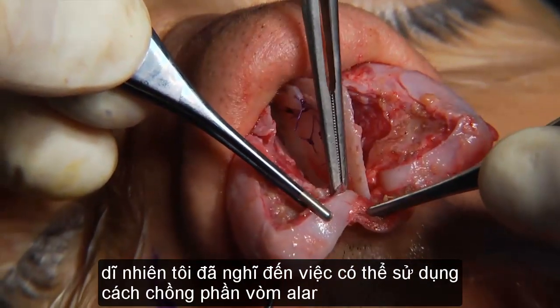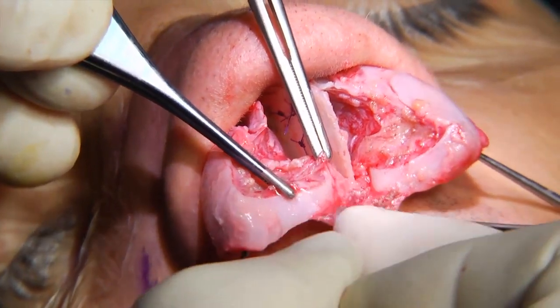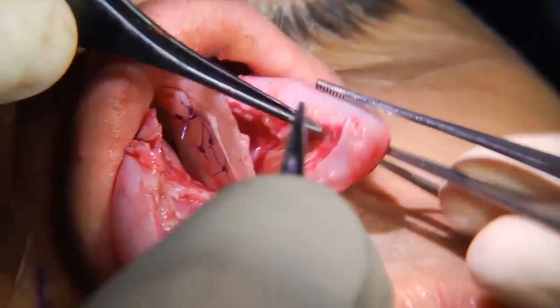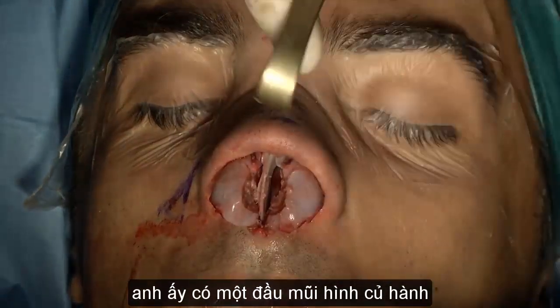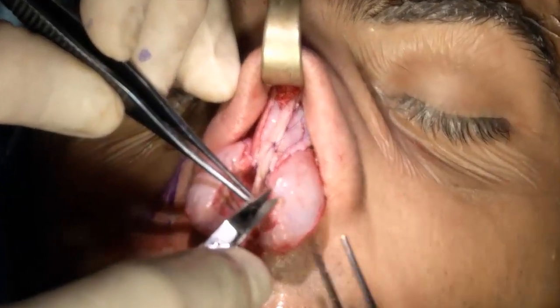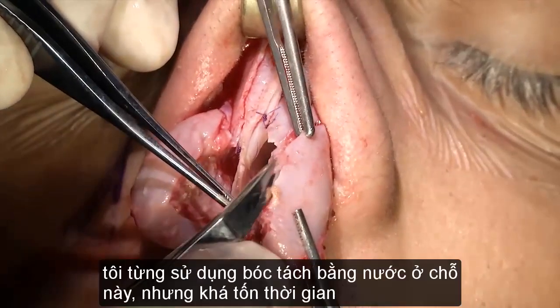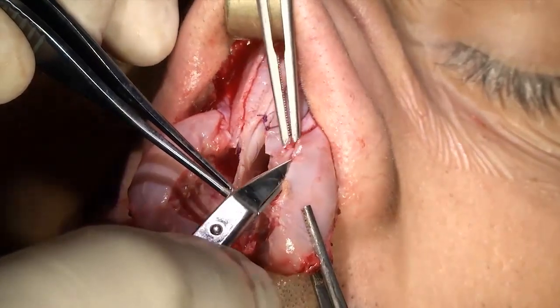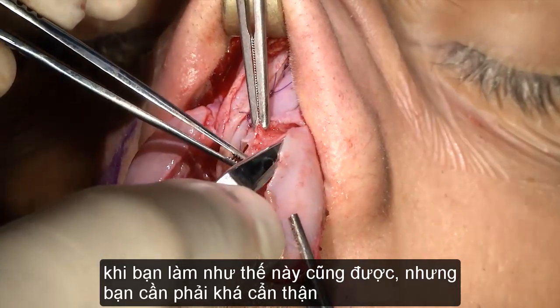You know, I'm thinking that maybe we'll just do a domal overlap. We'll see about this. So he really had a bulbous tip. I used to use hydrodissection here. It takes me too long and it's okay like this. But you have to be a little bit careful.